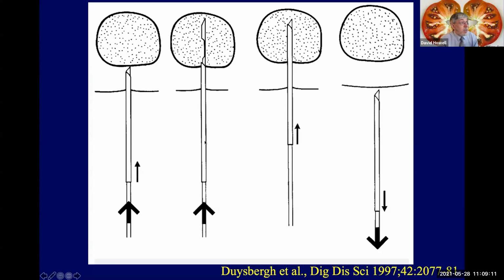The person doing the biopsy presses a trigger on the device, and two things happen in rapid succession. The first of those is that this needle springs into the tissue. And the needle portion has a little groove in it that's about 2 centimeters long. The tip goes through the tissue and pushes it aside, but it's spongy and it rapidly springs back, prolapses into the groove in the needle. And then very rapidly, the outer portion or sheath is advanced over the needle, and it shears off the tissue that has prolapsed into this groove, enclosing it all, and then the whole thing is pulled out.